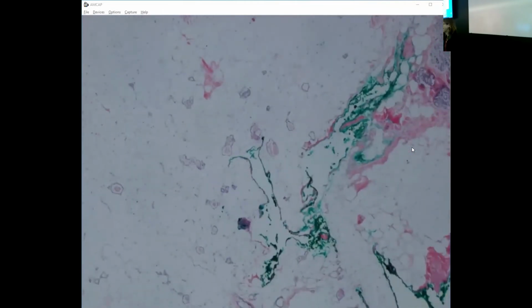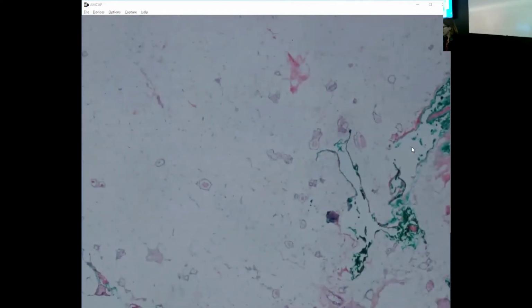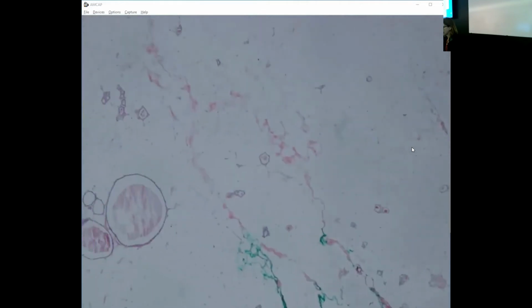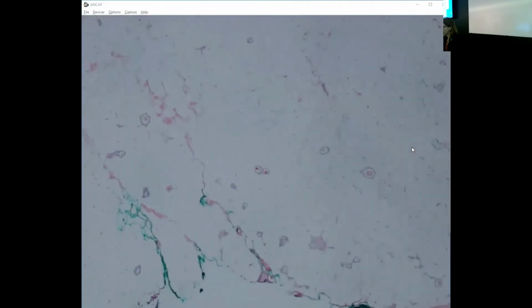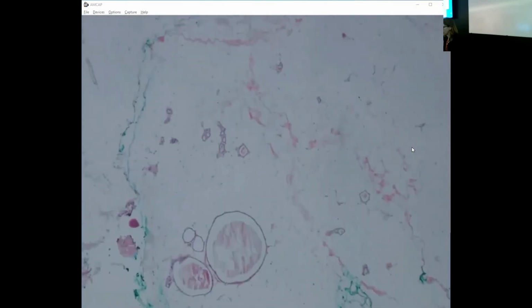I would think about microglandular adenosis. Yeah, why do you think about microglandular adenosis? What is it you're seeing so that other people know? There are these small glandular structures without myoepithelial layer, and there is this pink material inside. Yeah, and it's very haphazard as well. It's just all over the place. So this was a totally incidental finding in a case, and it was right by this lateral inferior margin here, and kind of cute.